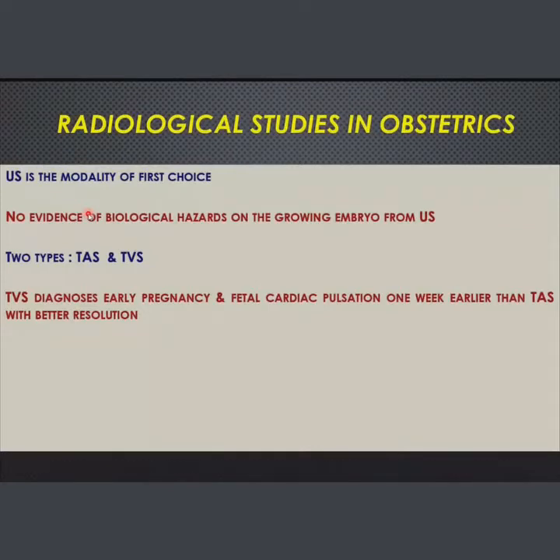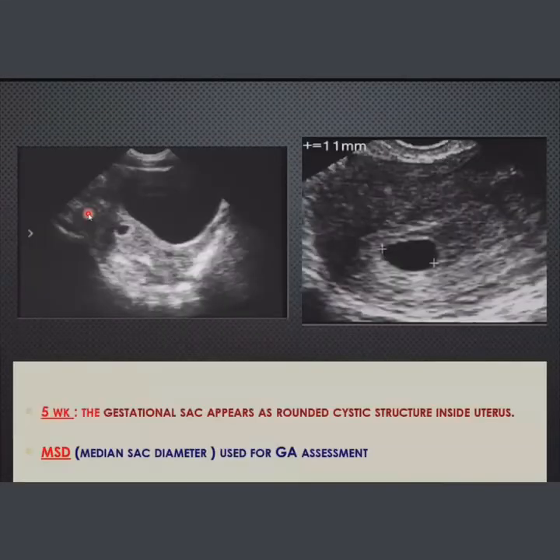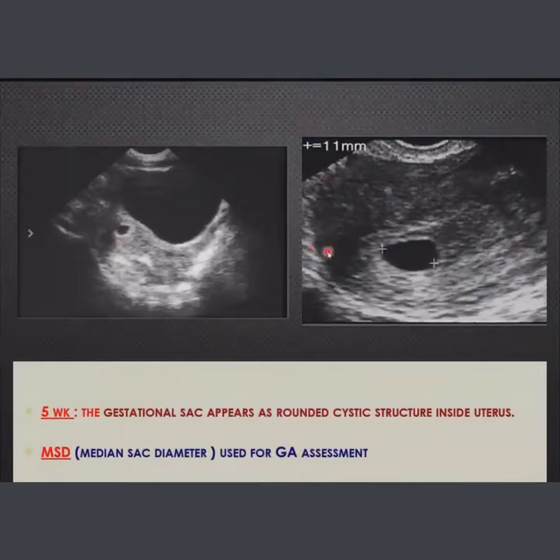Few points on obstetric imaging, and you have surely taken it in gynecology, but a little to refresh you: ultrasound is the first modality and the modality of choice to assess whether there is a pregnancy or not. After the lab test, we will see the pregnancy, the gestational sac, and the fetal pole in early pregnancy, and we can do dating and see whether it is viable or not.